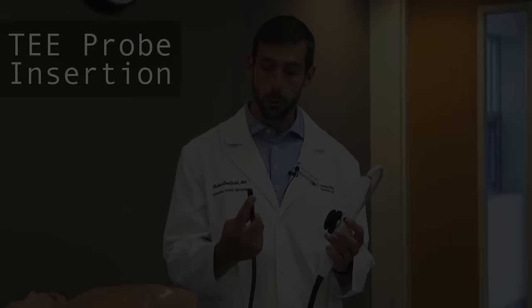Hi, my name is Rob Arnfield and I'm from Western University in London, Ontario, Canada. Myself and Dr. Atul Jadka, an internal medicine resident at Western University, will now take you on a tour of point-of-care transesophageal echocardiography.